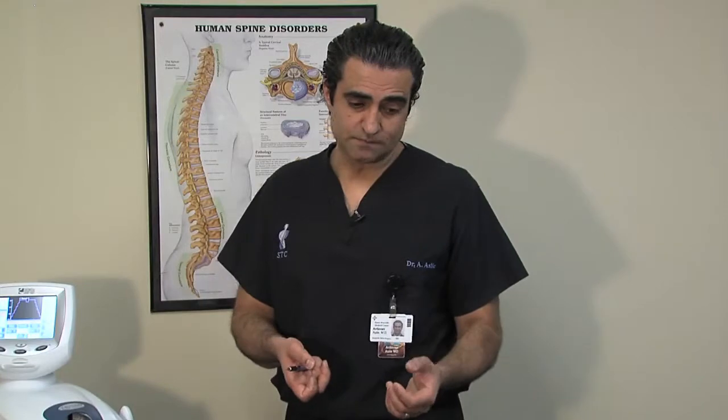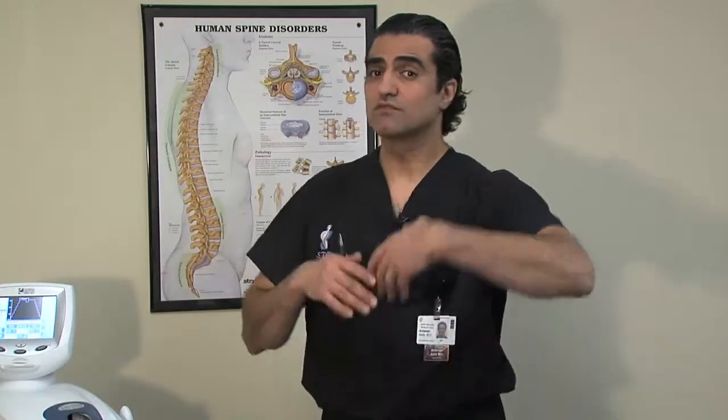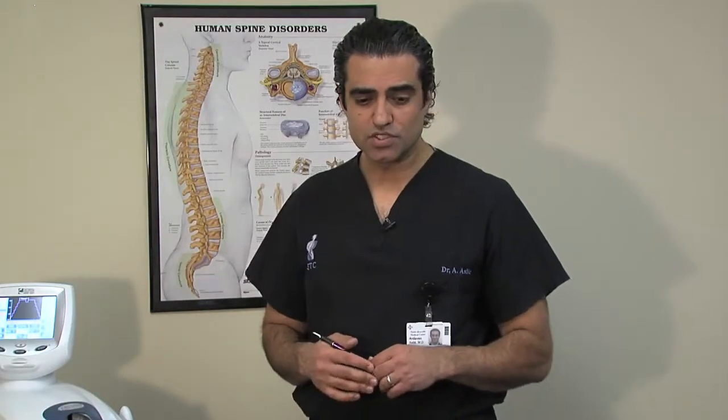Now, of course, when we put the patients on the table, we always tell them that about 1 out of 10 patients can experience more pain the night of or the next day, simply because it's just very difficult to break off the scar tissue. Now, I tell my patients that if that happens once or twice, we'll continue traction for the third episode. However, if we try 1, 2, and a third time, and the pain continues to go up or is not getting better, then we stop the procedure. And as I said, it's a pretty safe procedure and we have very good results in terms of relieving the neck and back pain, especially if the pathology is mild.